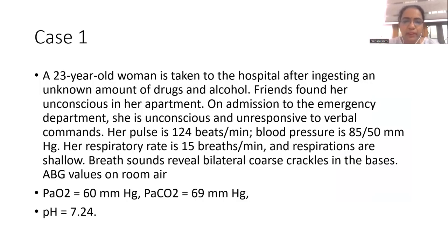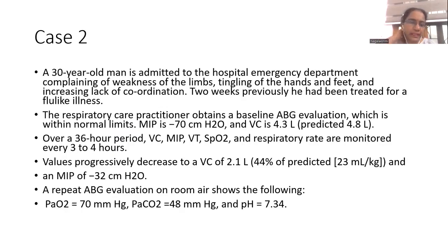Respirations were shallow. The breath sounds reveal bilateral coarse crackles in the bases, and the ABG values indicate a PaO2 of 60, which is low, a PaCO2 of 69 millimeters of mercury, which indicates carbon dioxide accumulation, and a pH of 7.24.